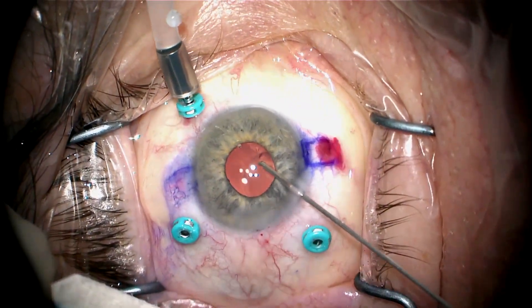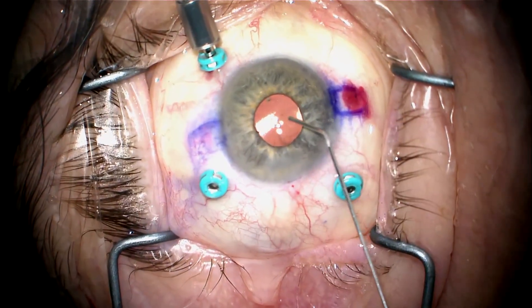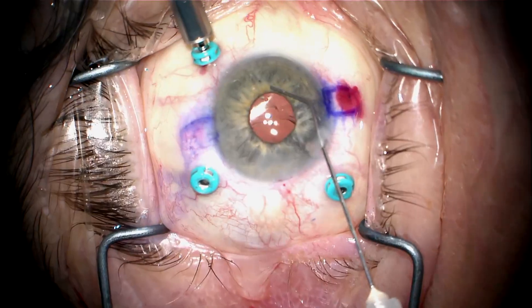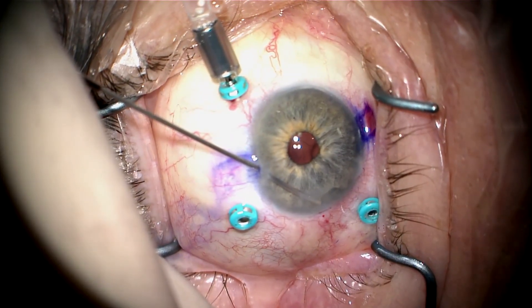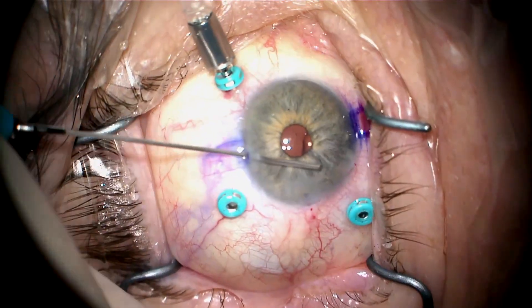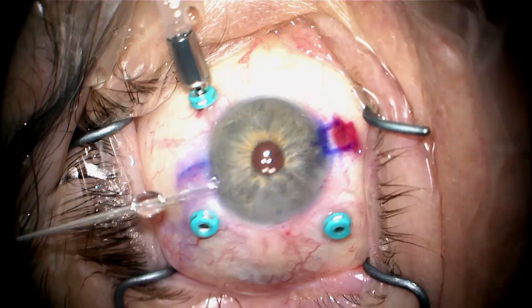I'll now remove viscoelastic from the anterior chamber with the vitrector with the cutter off. I'll bring the pupil down with Miochol. Because this is such a large eye, I'm going to make two peripheral iridotomies with the vitrector — one temporally and one inferiorly — to guard against reverse pupillary block.